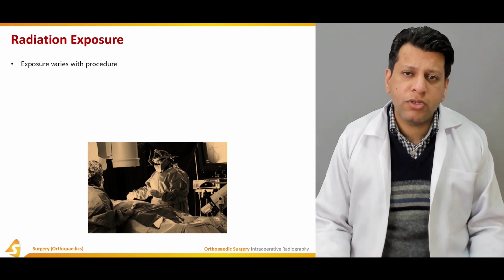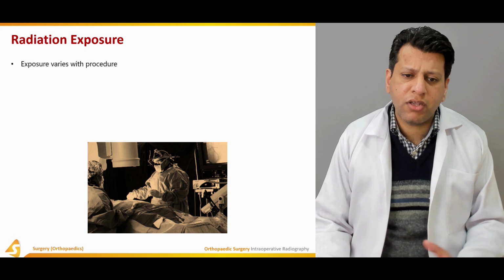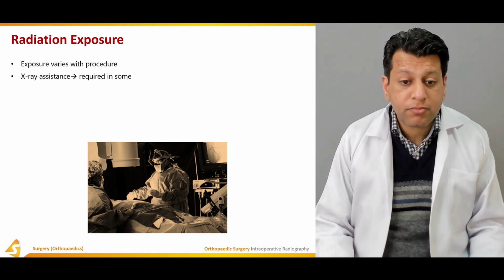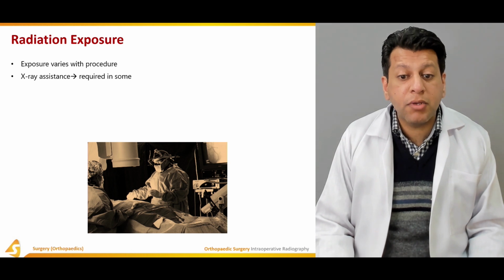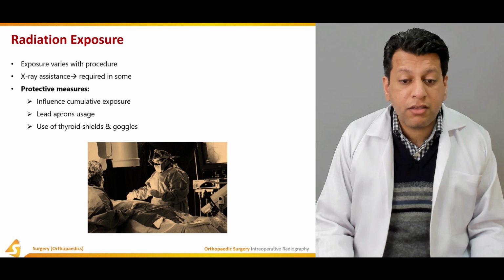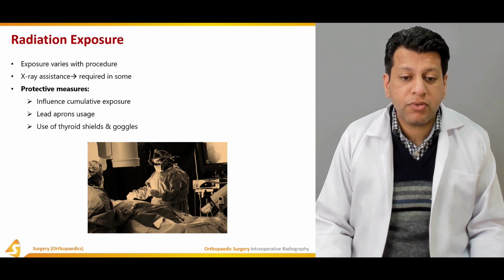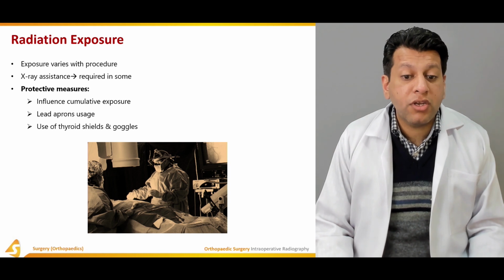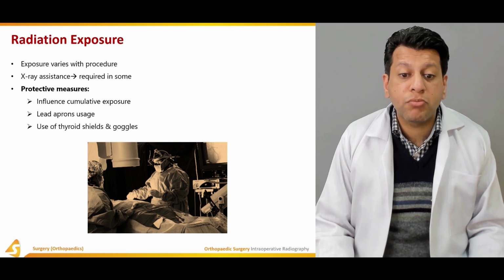But not all procedures require continuous radiation, so it varies with different procedures for different times. X-ray assistance may be required in some. Usually the protective measures are needed so that we are protected from the influence of cumulative exposure.